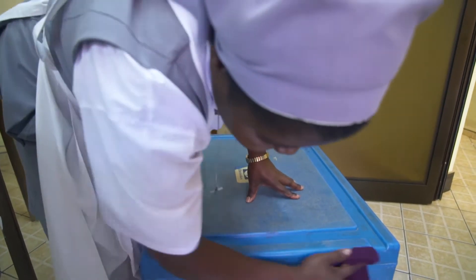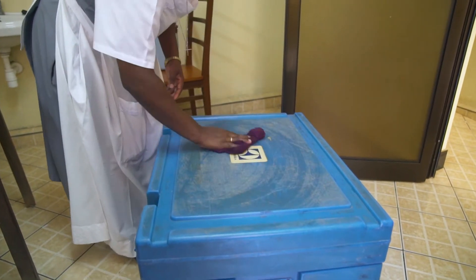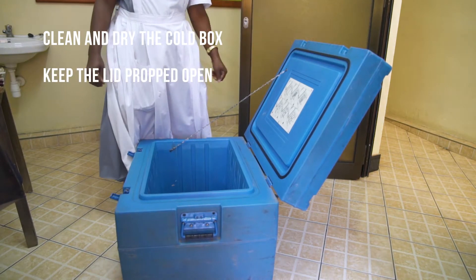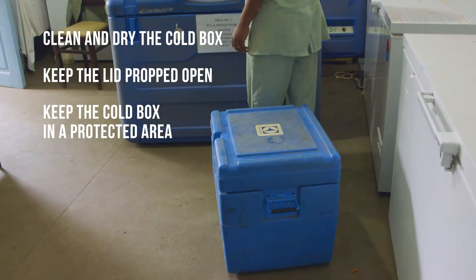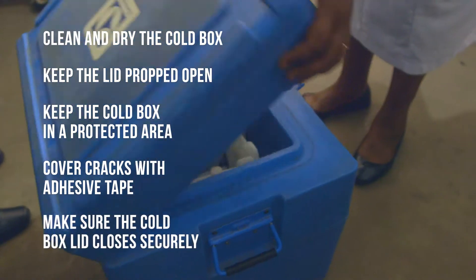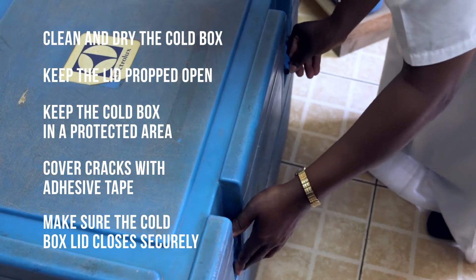After each use, remember to maintain your cold box so that it stays in good shape for the next time. Clean and dry the cold box. Keep the lid propped open. Keep the cold box in a protected covered area. If your cold box has a small crack, cover it with adhesive tape. Make sure the cold box closes well and that the hinge screws are secure.